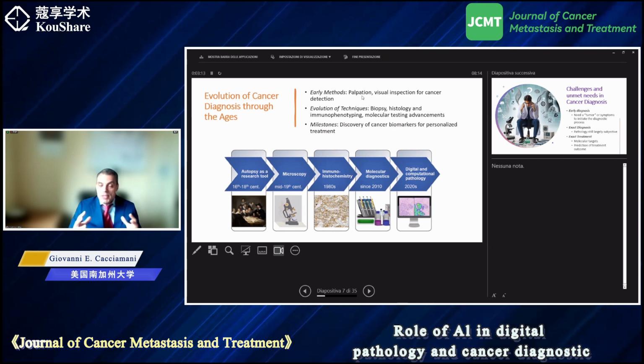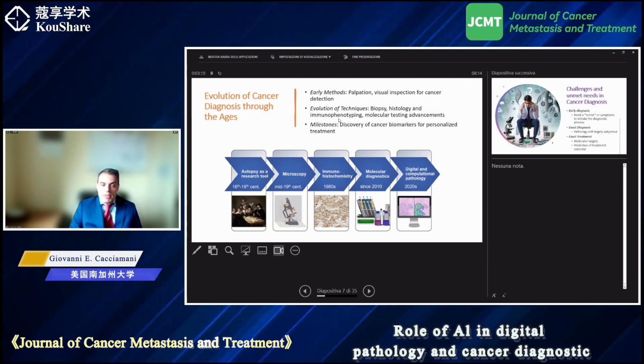the tumor, which means mass, the visual inspection, to more evolved techniques, and then the role of pathologists with the biopsy, and particularly the role of microscopic pathology implemented, and we know the impact that immunohistochemistry had on cancer recognition and classification in recent years.